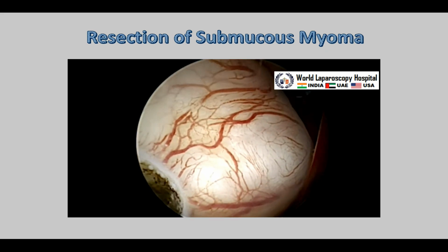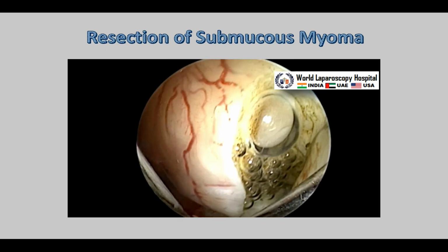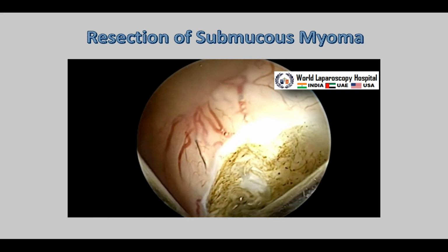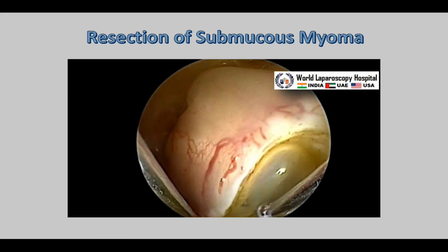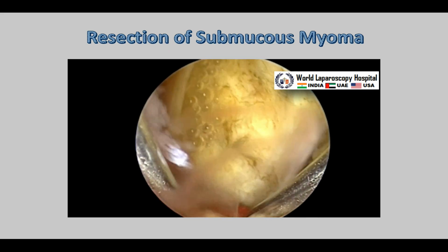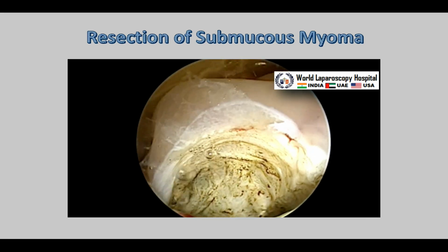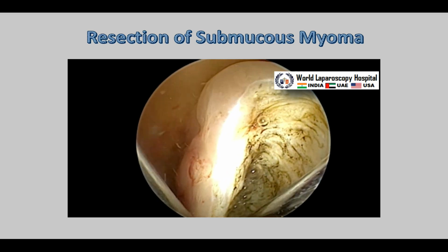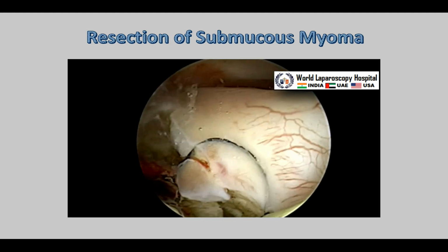Hook, look, and then cook. Never activate in open circuit, always come darker to brighter. And you will keep on resecting. Distal to proximal means darker to brighter. There is a separate learning curve of operative hysteroscopy. During the diploma period, we have one practical for operative hysteroscopy where you will do this resection yourself. We have one model to do this resection. So slowly you will keep on cutting.